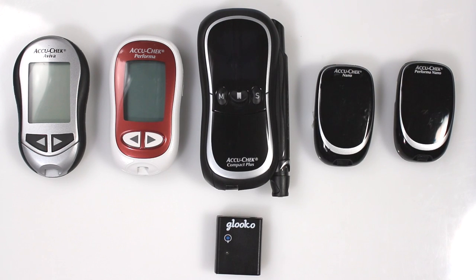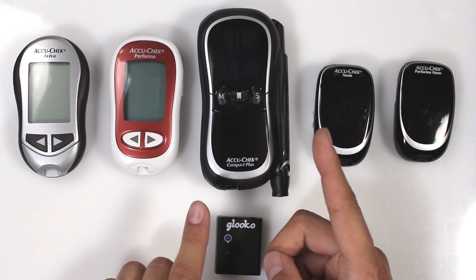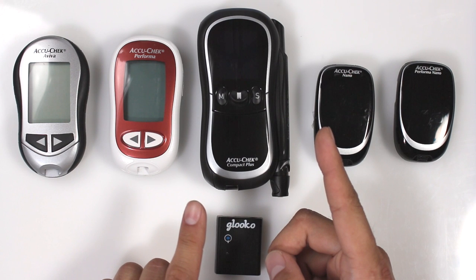For the AccuCheck Go, which is not pictured here, press and hold the Power button on the right side of the meter and the left arrow button on the front of the meter for 2-3 seconds until you see the Sync icons appear.